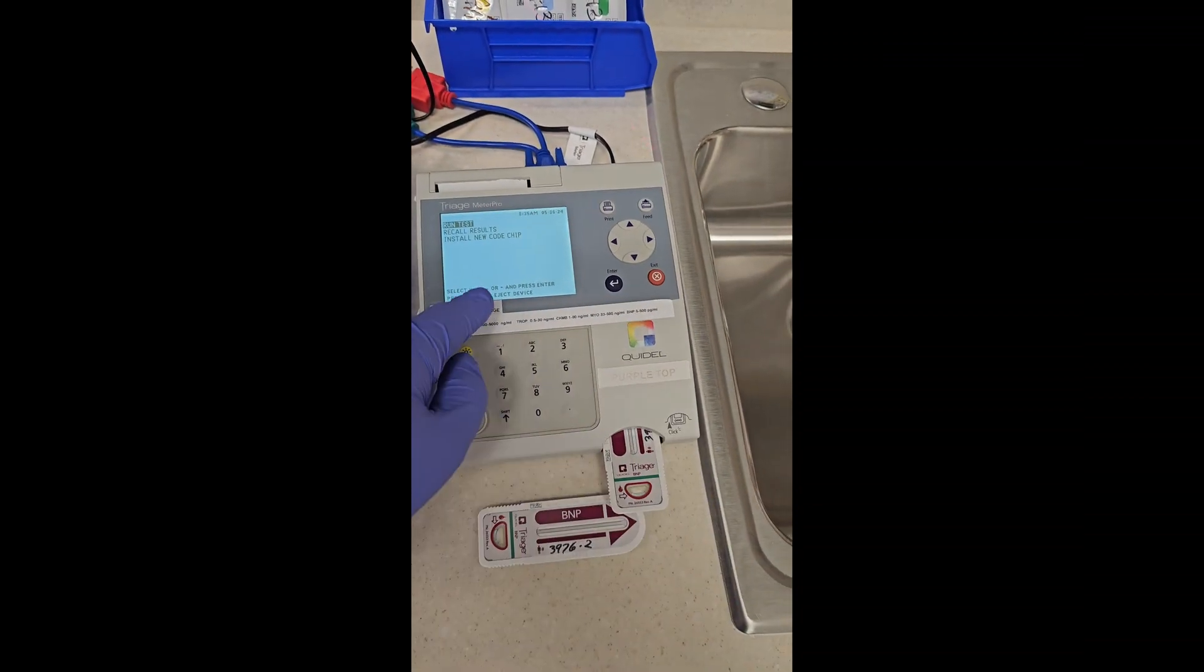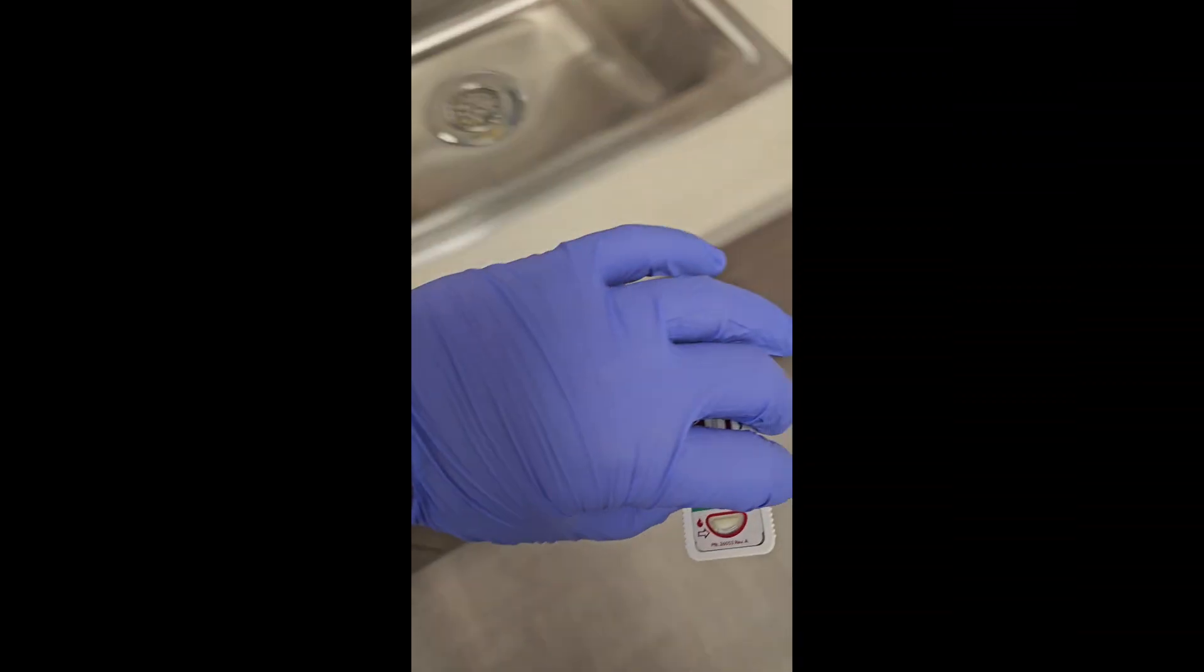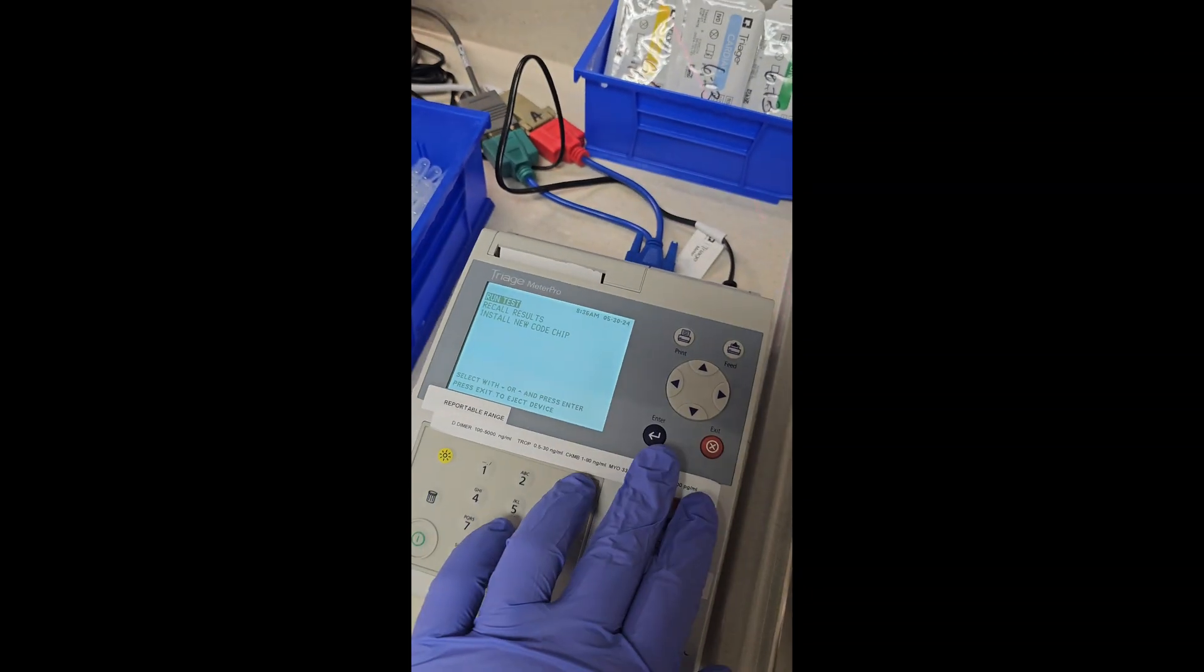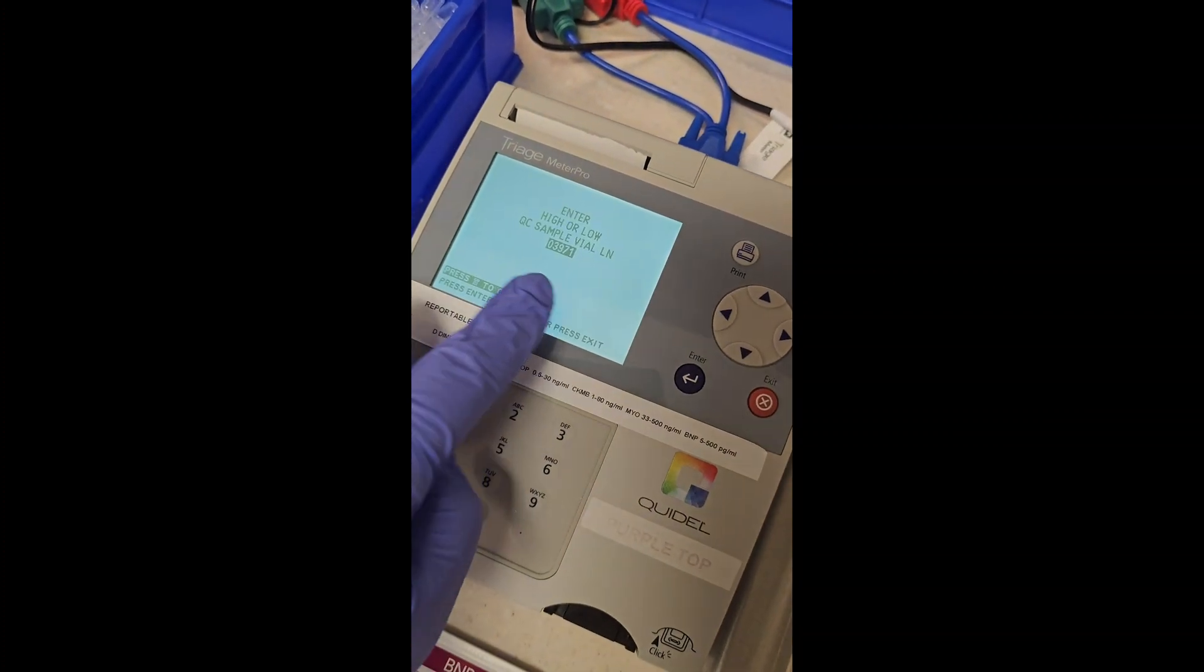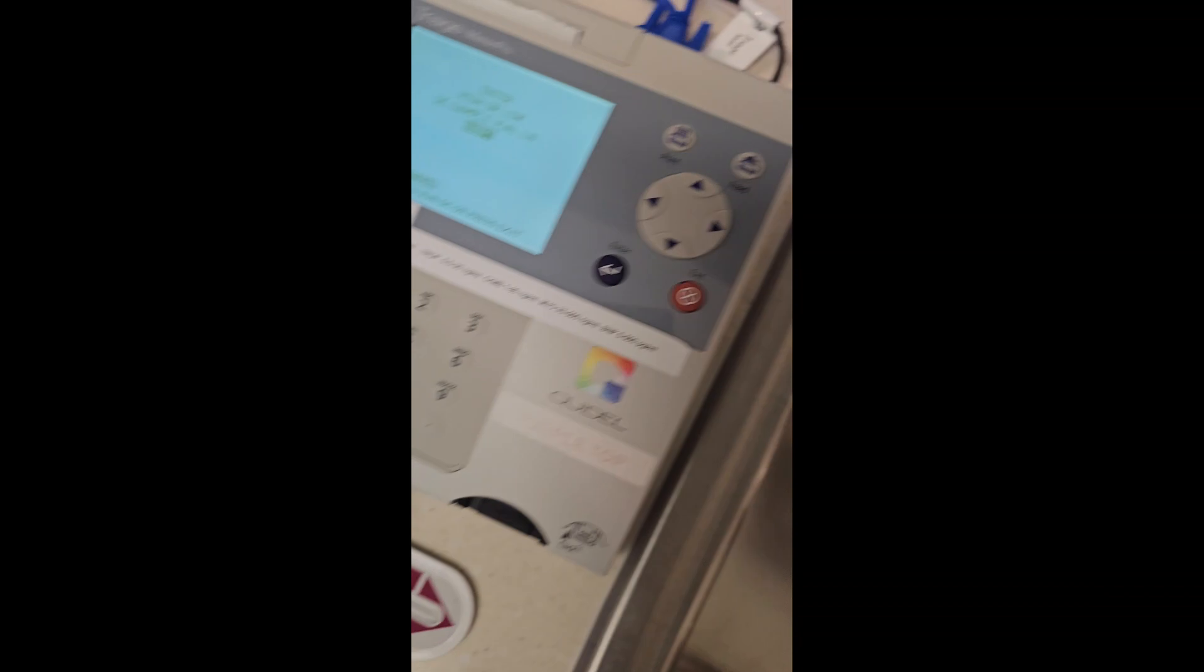Hit exit to go back to your main screen. We'll take our level one and toss that. Run test. It's the same process for level two. QC sample. That number has changed now, it's 3976.